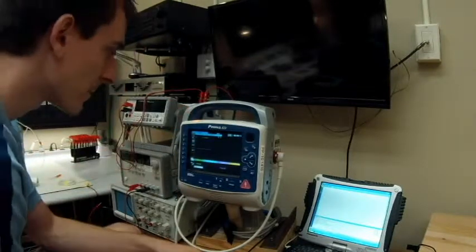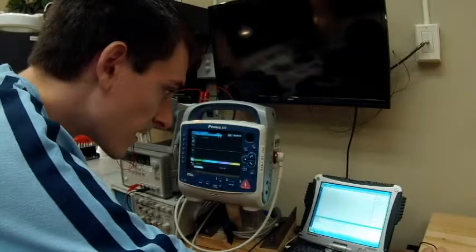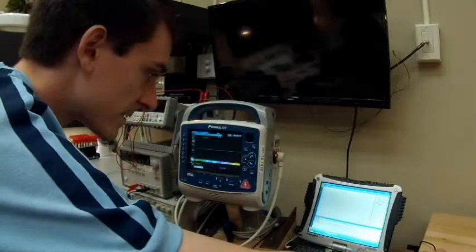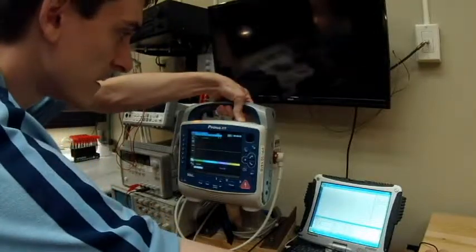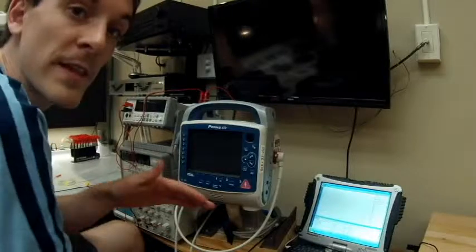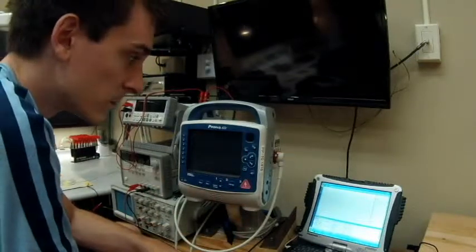The SpO2 sensor is currently being calibrated so I'm going to mark that as not applicable for now. Here's where we start invasive blood pressure testing. This is what I call step two — step one covers everything to do with the Impulse 7000, and step two covers everything to do with the other unit. I love how Zoll has it set up.